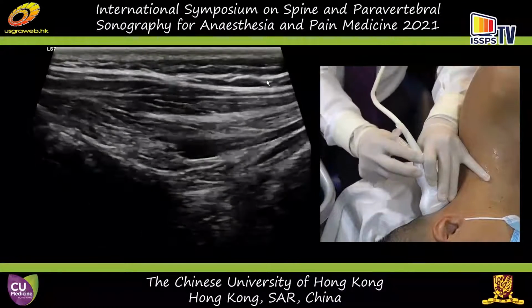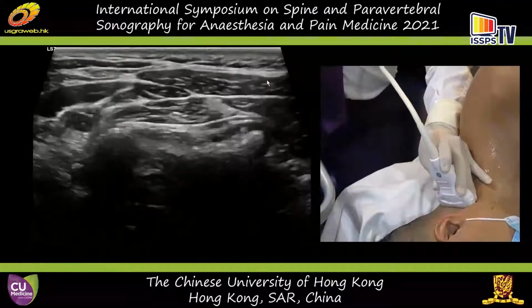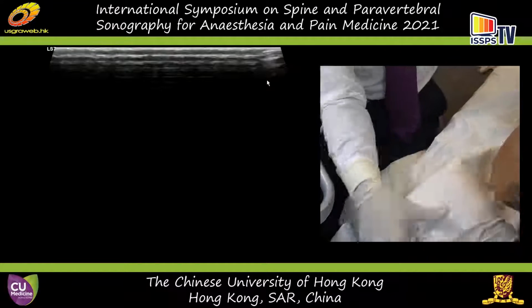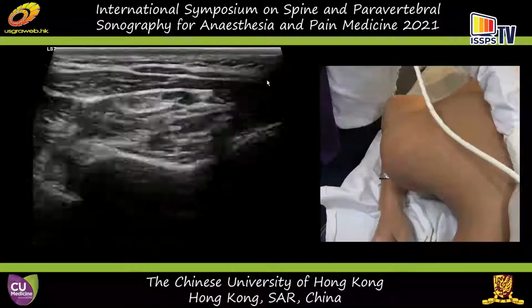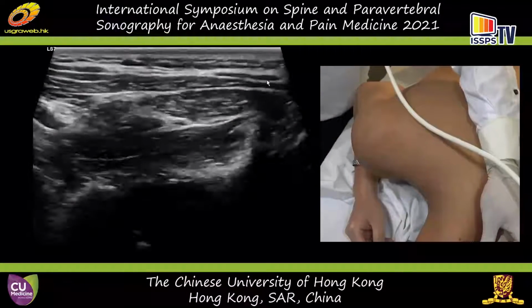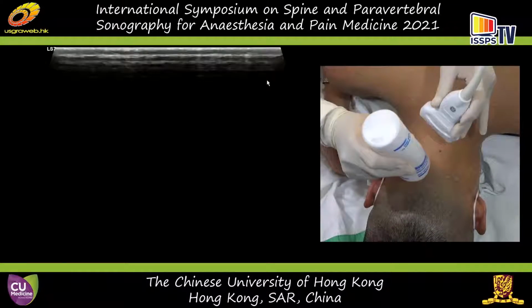If I turn the transducer into the transverse view here, and this time I'd like you to lie prone, please. You go under the chest. Okay, as flexible as possible again. If the patient is lying prone, let's do a bit of the landmark.